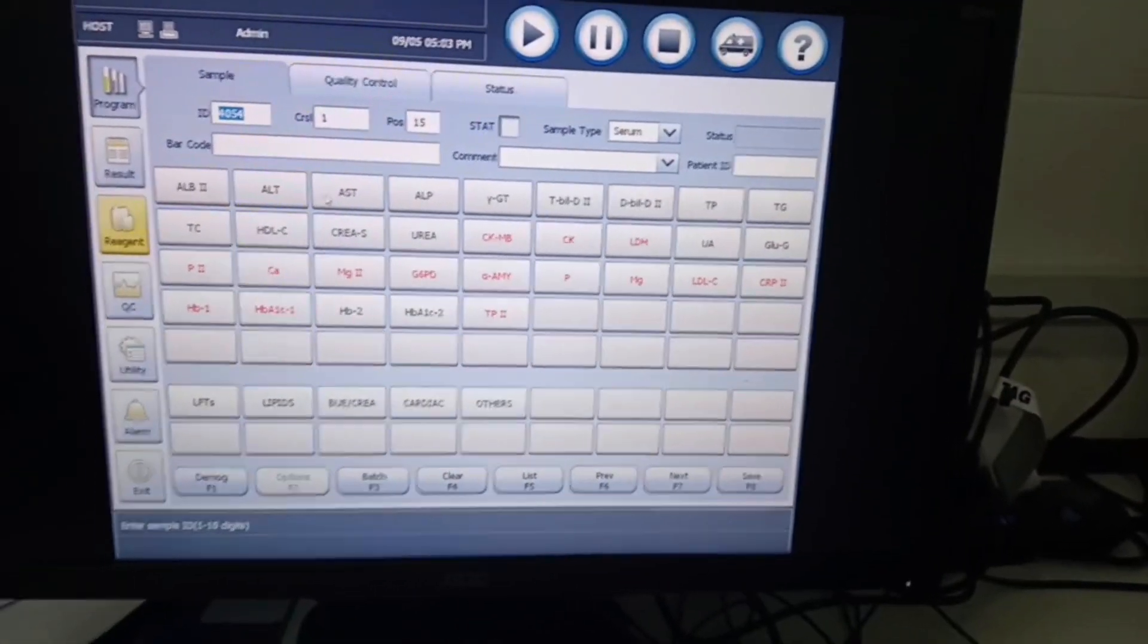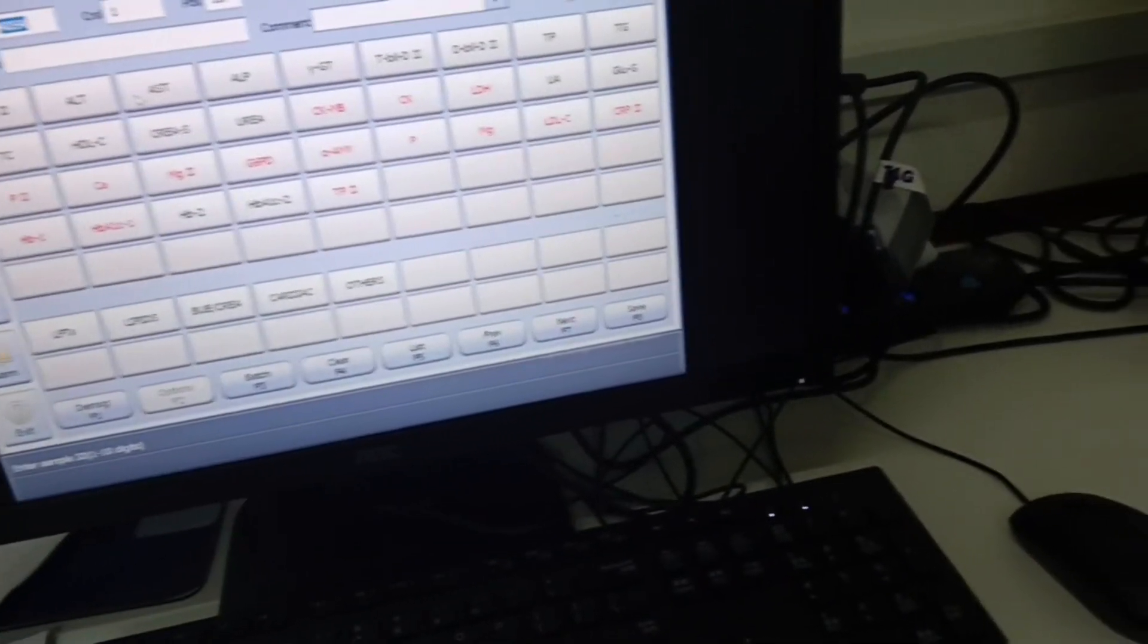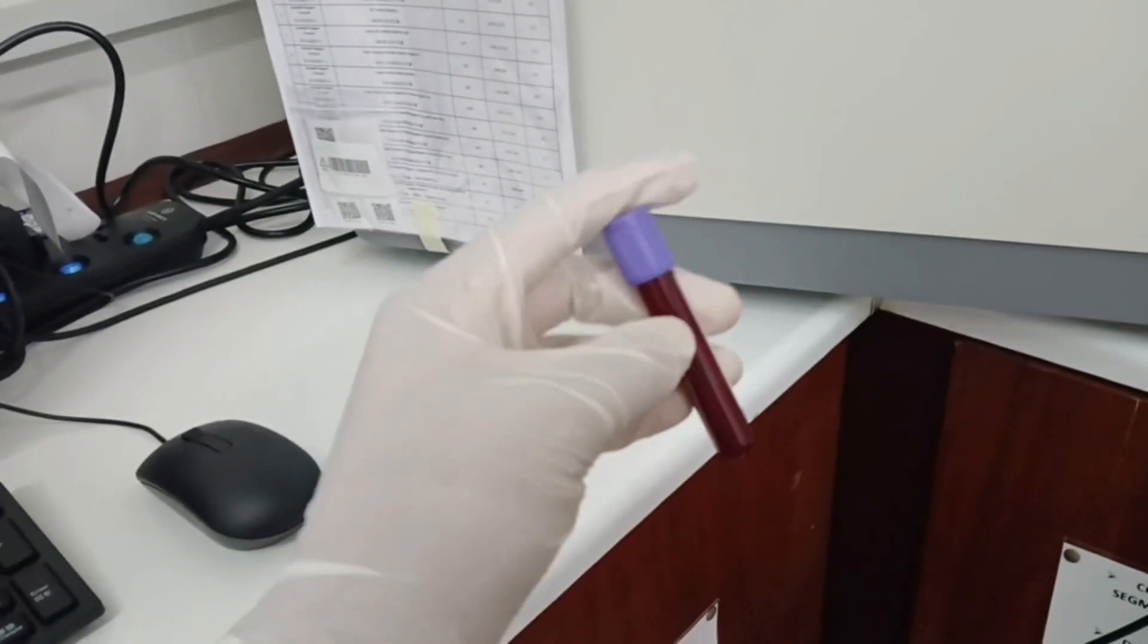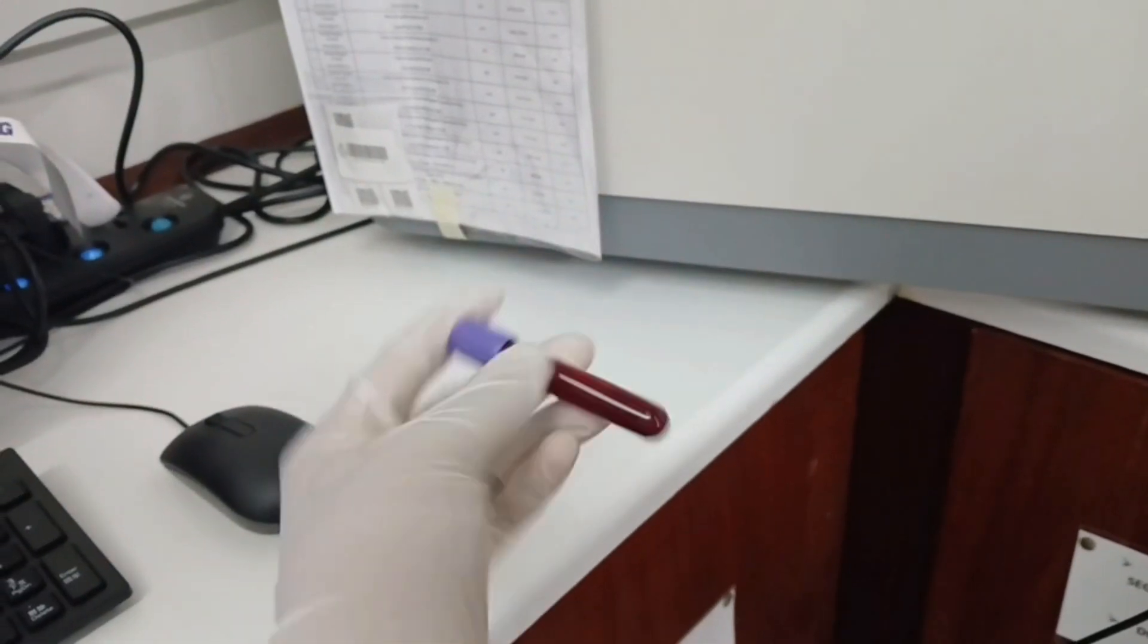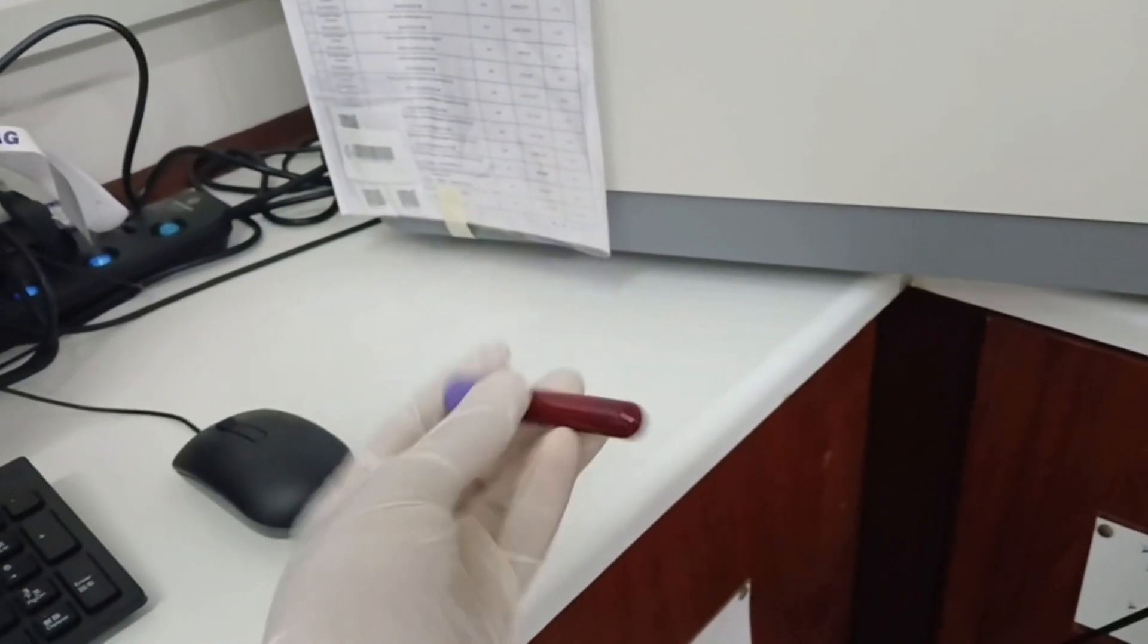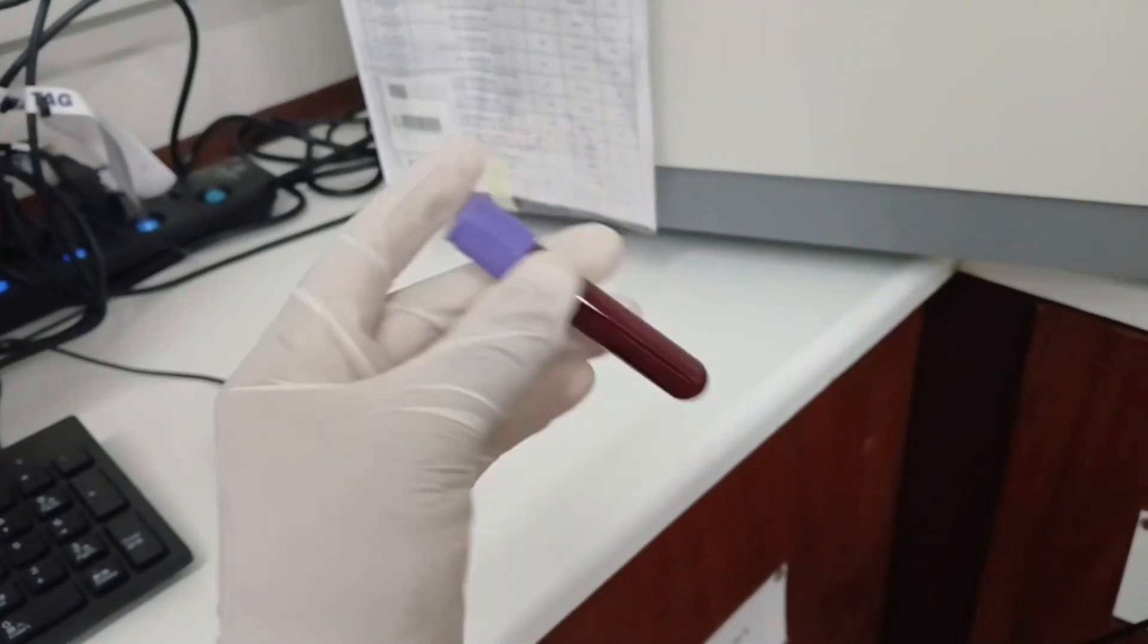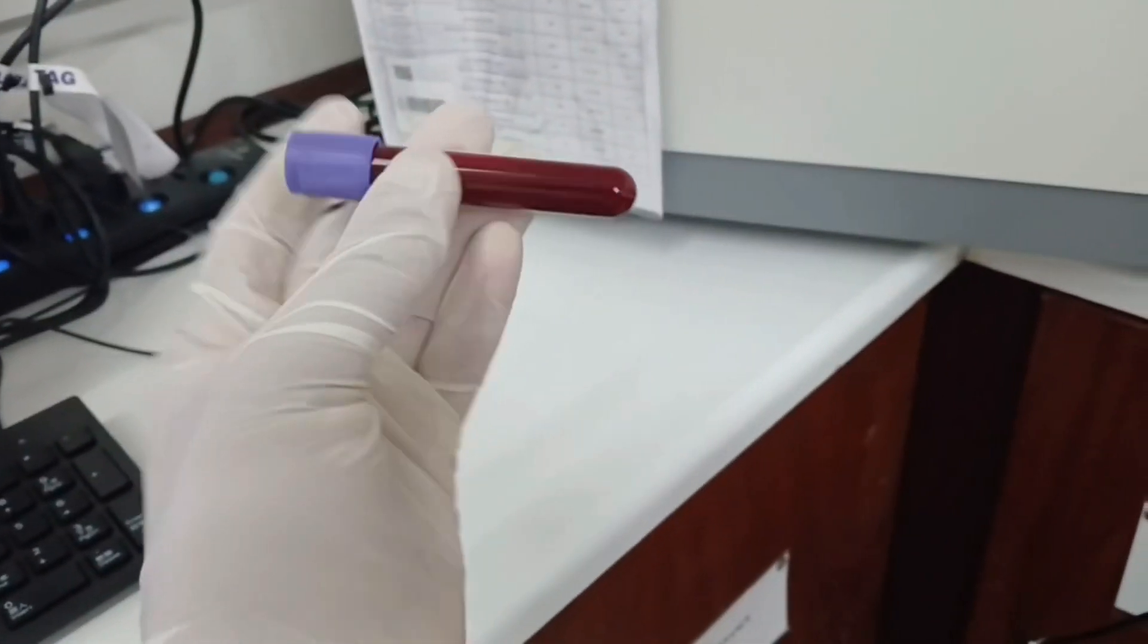With HbA1c we use EDTA whole blood, so this is our sample. But we are going to centrifuge it at 2000 revolutions per minute for five minutes before we can use it to do the test.